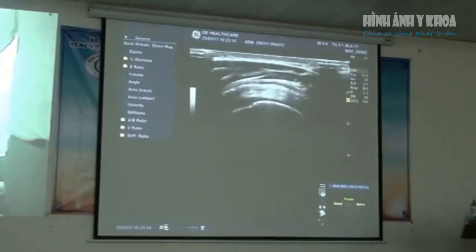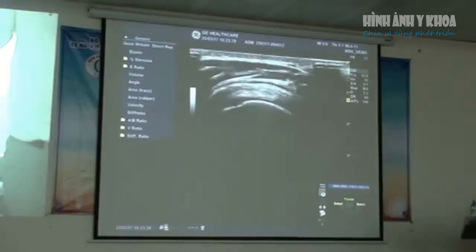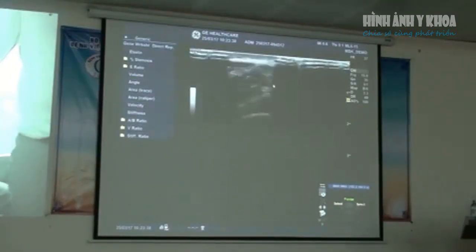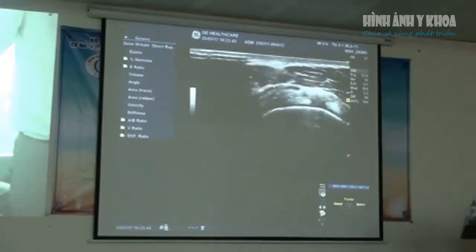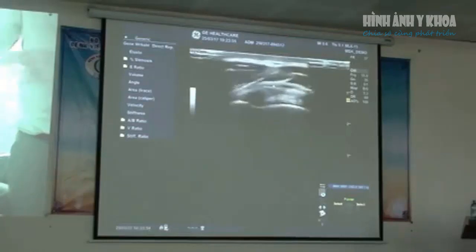However, if this patient, when they brought their arm up, said yes, that is reproducing my pain, that would be significant. So you need to correlate what you're seeing on the screen to the clinical presentation. Even if there's a little fluid in the bursa, if the patient says it hurts on movement, then it is pathological. Unfortunately, ultrasound is very good at finding things that don't really matter.